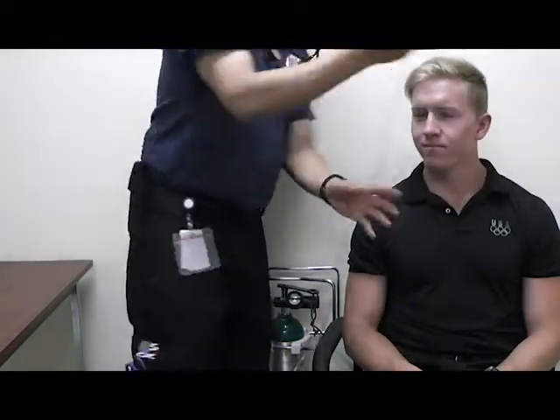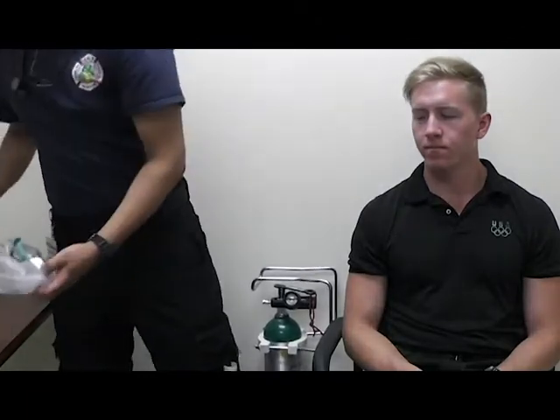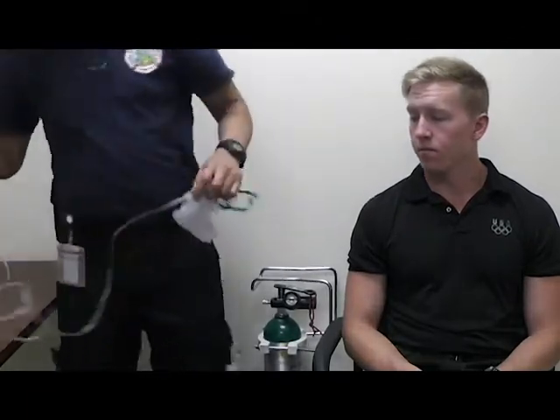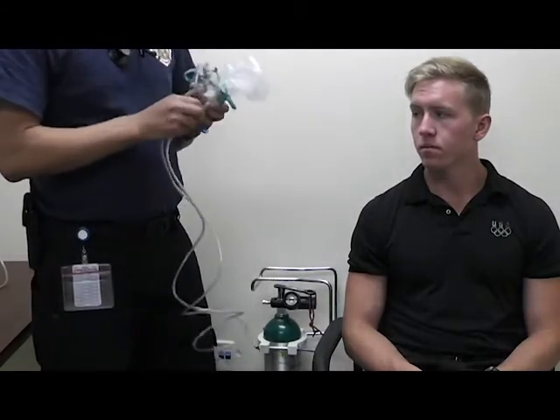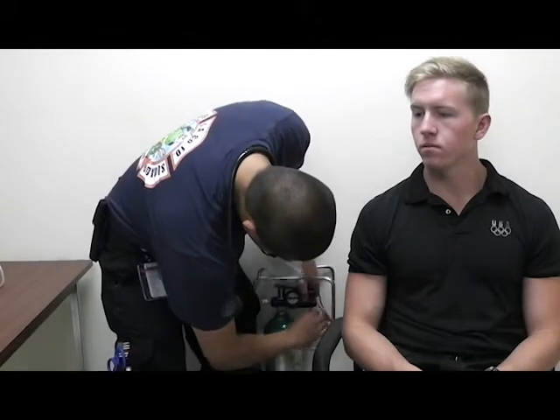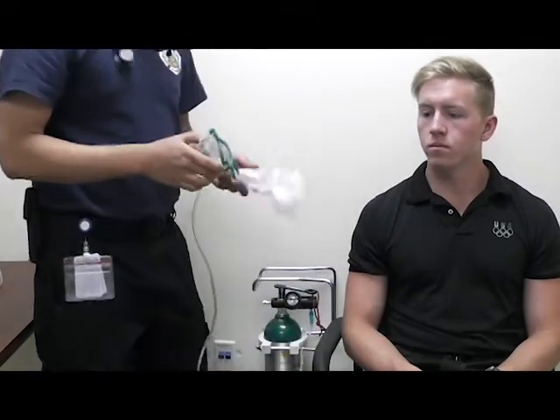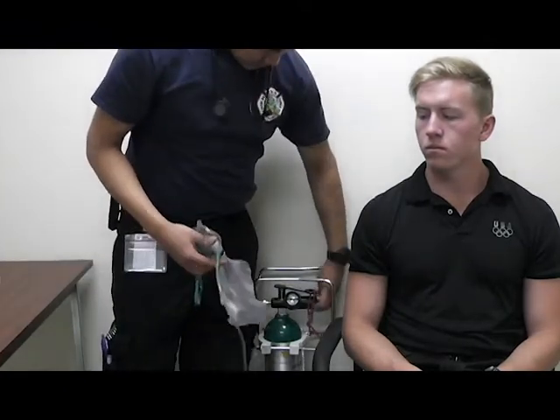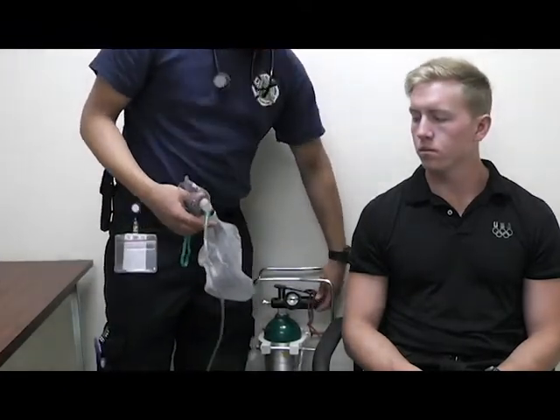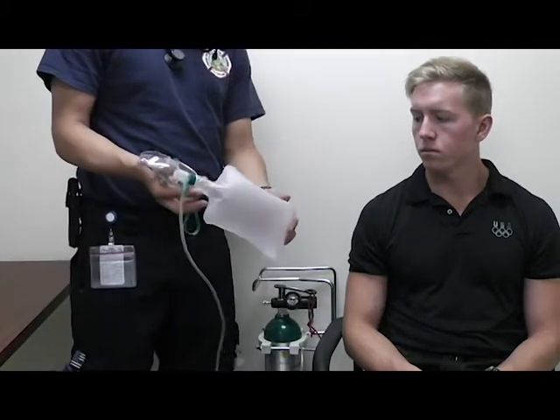The next oxygen administration method you can use is a non-rebreather mask. You attach all your tubing and connect it to the tank. When you use a non-rebreather mask, it's important to note that when you're turning on the oxygen and inflating the bag, you press down on the inside of the mask until the reservoir is filled.